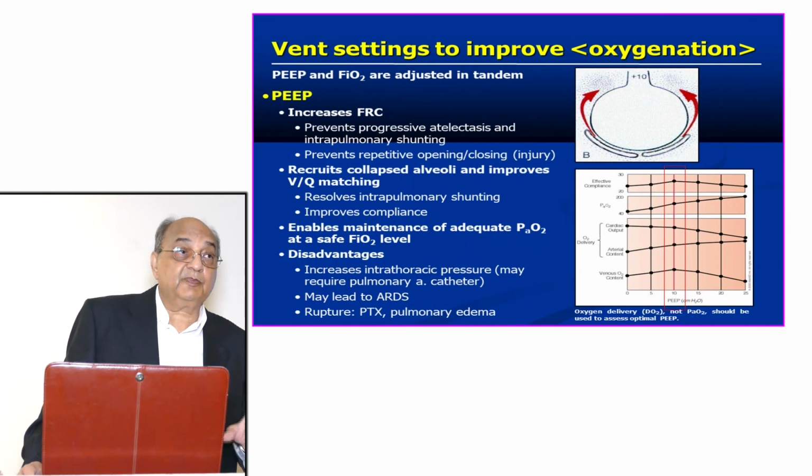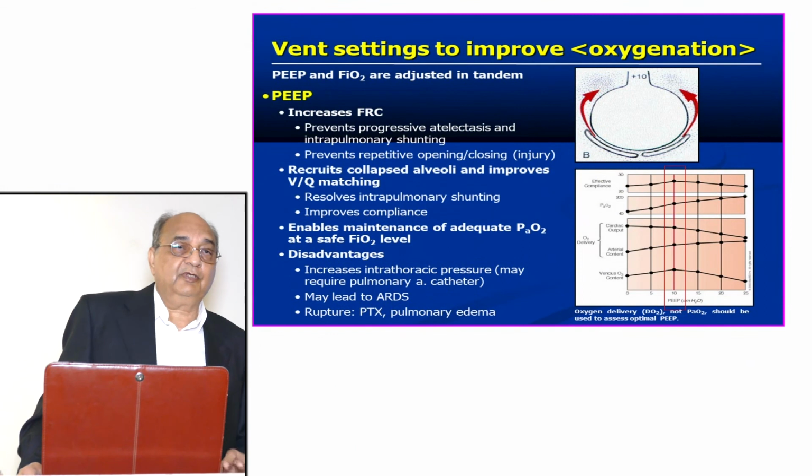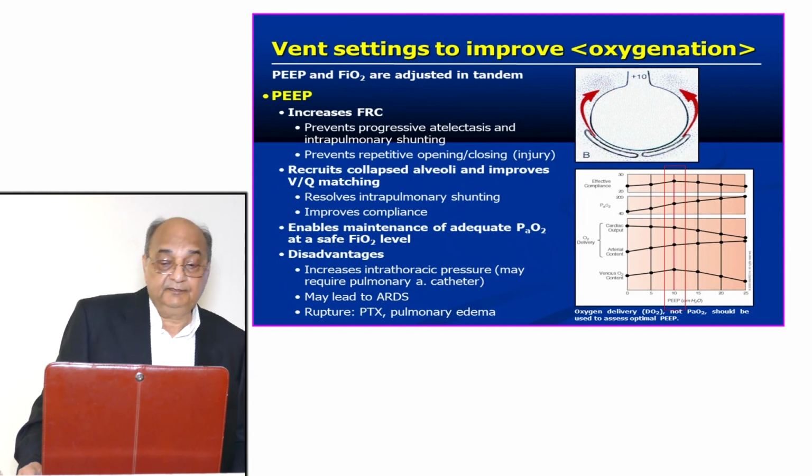Special care means special care by the nurse, and you should be very vigilant. One person should always be sitting there. It's not like you press the button and you have started the ventilator and you go around. No, it's not like that. If you're going for a break, another person should be sitting there and constantly watching the patient. Anything can happen. So putting a patient on a ventilator is a serious thing, and to look after the patient who is on a ventilator, it needs very vigilant nursing care.